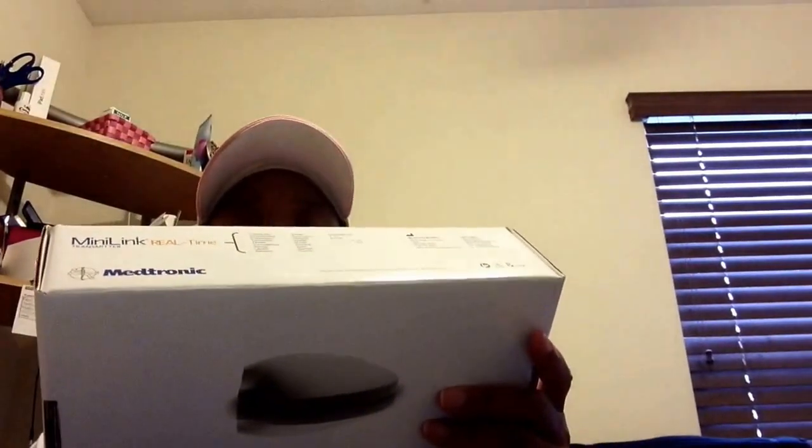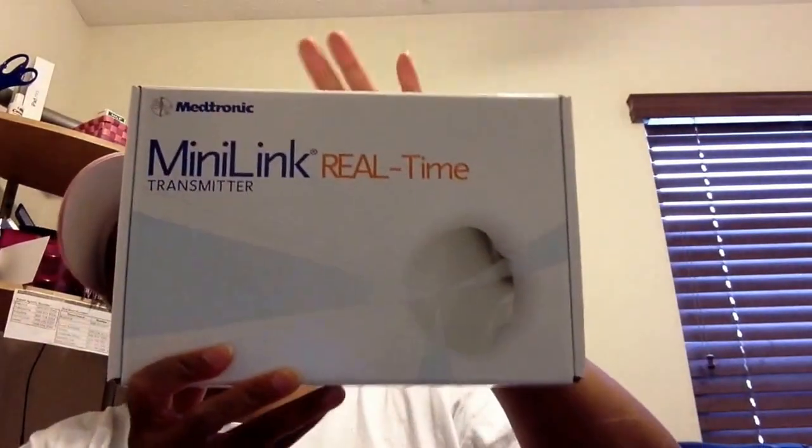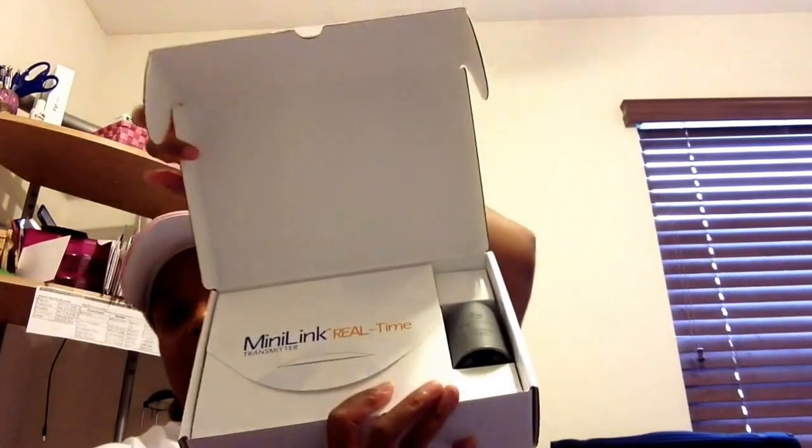I also received the Minilink Real-Time Transmitter — this is the new CGM that comes with the pump. On the side it tells you the style and all the different items that came with it. I already opened it because they wanted me to charge it before my class. This is what came in the box and what it looks like. It's really cool how it opens up — it's a really cute package.